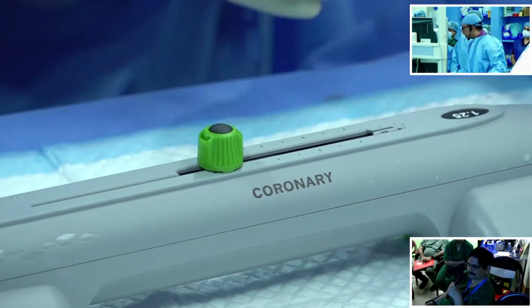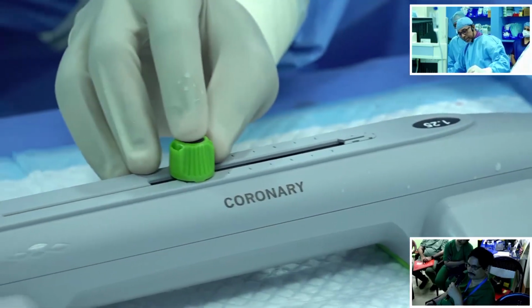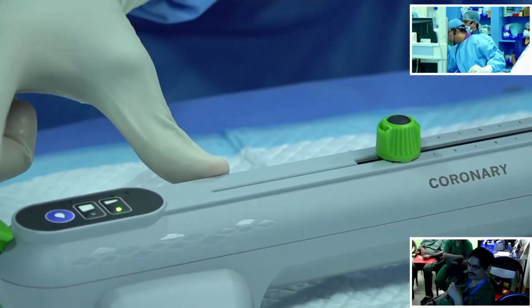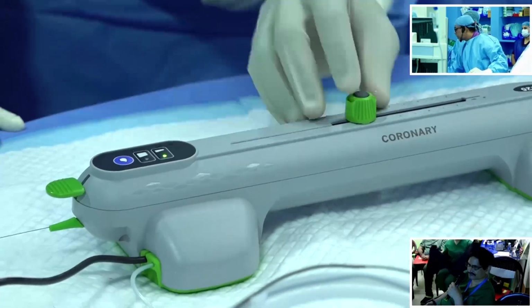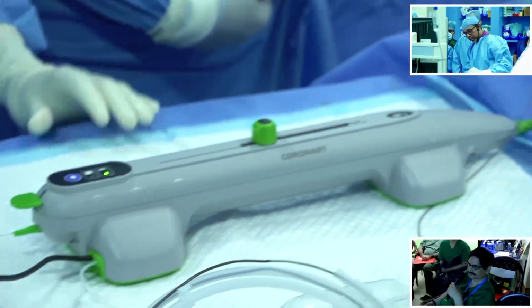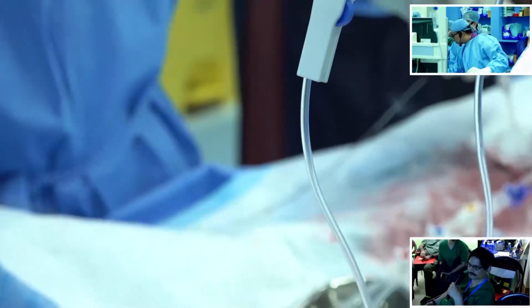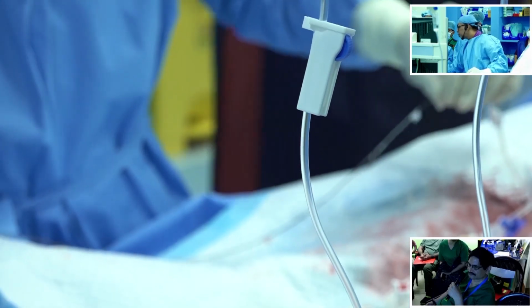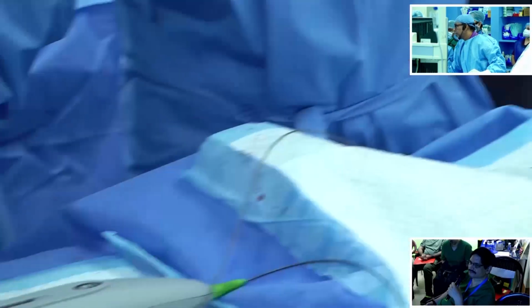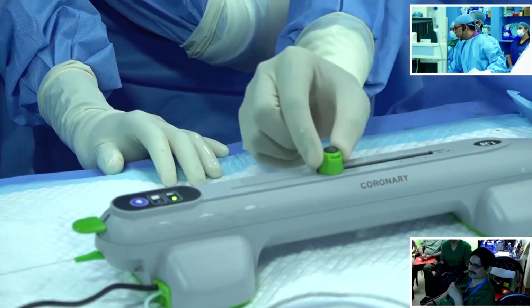Now first thing we are going to activate it, see whether the crown is rotating well. Always make sure that you have the brake down, otherwise you won't be able to switch it off. Activated. Now that's how it looks like. You're seeing the spurting saline and it's rotating well. Now we switch it off. Now again you need to move the knob forward and backward. Show the handle now. Now you can also move it forward and backward. Make sure that it's working well.